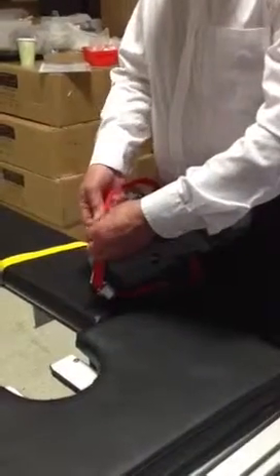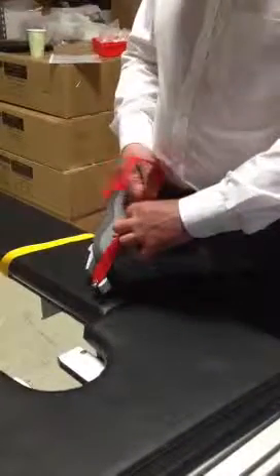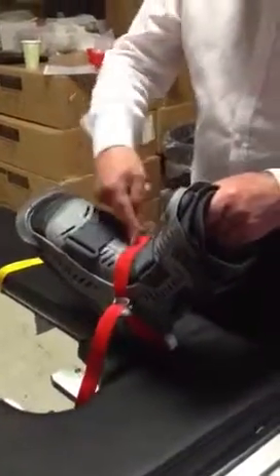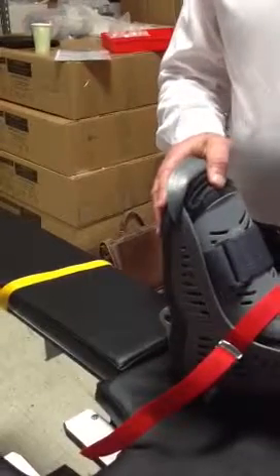Is this when you pump now? When you've got it all pulled as tight as you can. The red strap is ours, and that's because this boot isn't designed with the primary purpose that the foot shan't pull out of it. So that's why we put this strap around the corner, so the highest tension is right into the root of the foot here. Because what you don't want is, when you apply traction, to pull the foot out basically. Then you pump up, and you can just tell by bounce pressure on here.